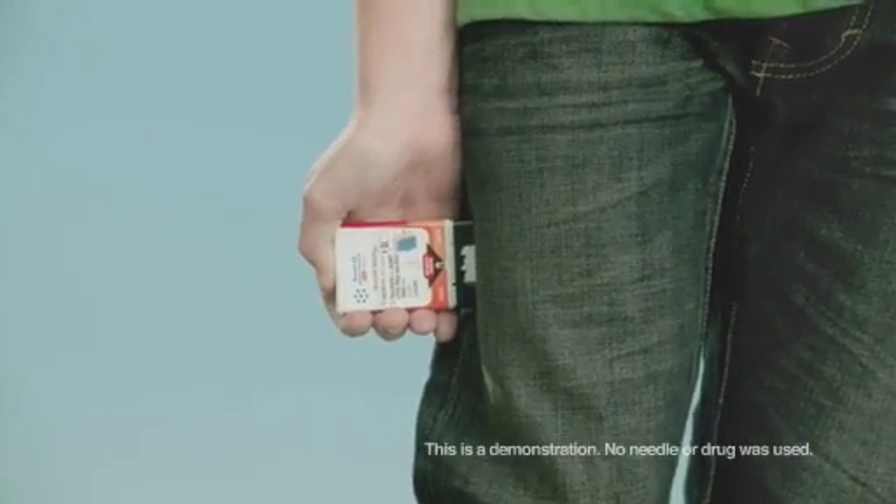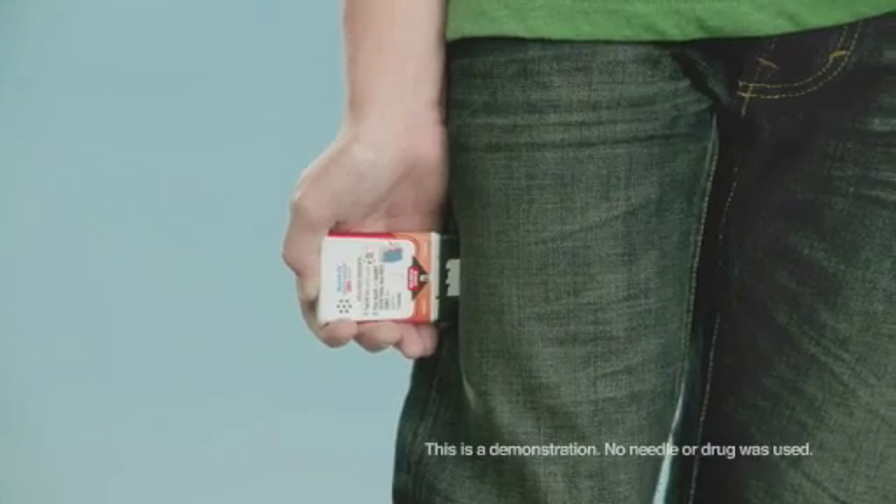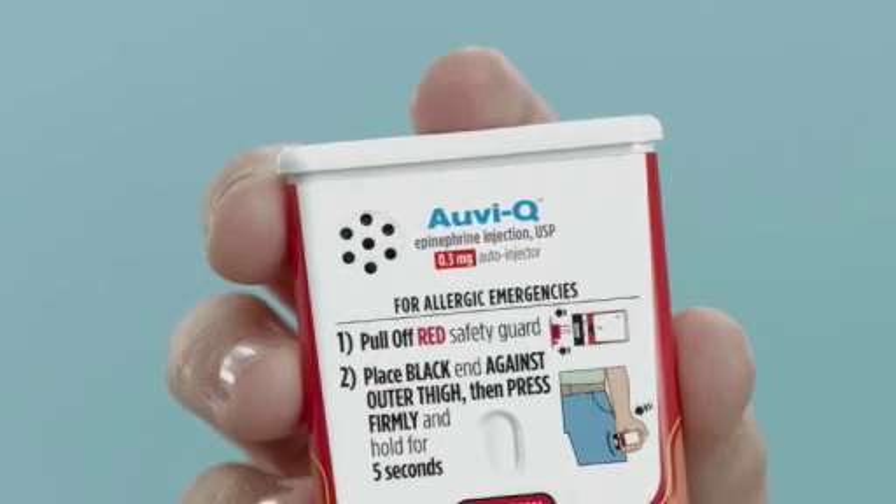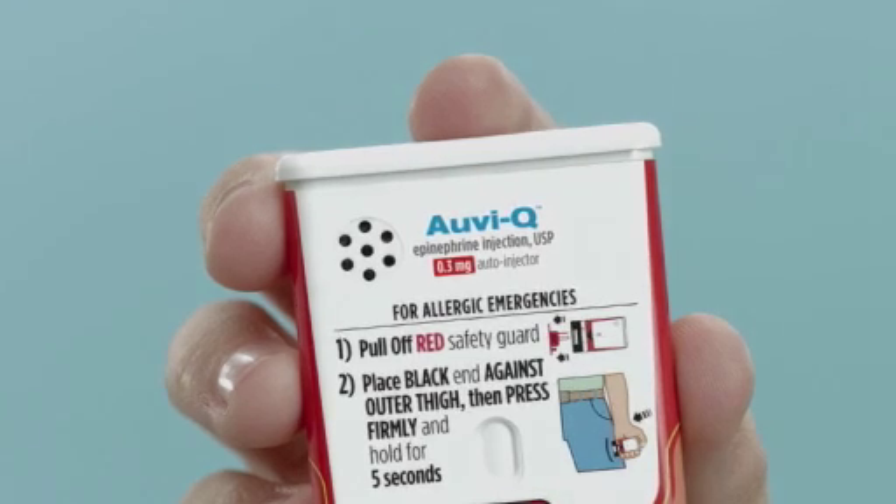Five, four, three, two, one — injection complete. Seek emergency medical attention. This device has been used and should be taken to your physician for proper disposal and a prescription refill.